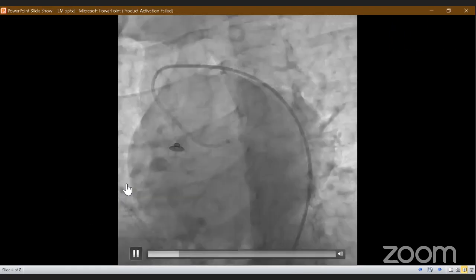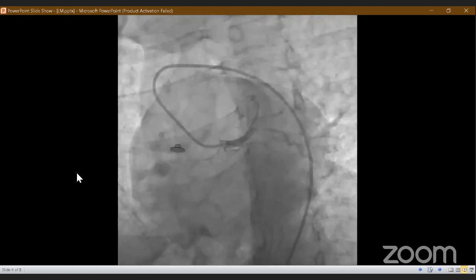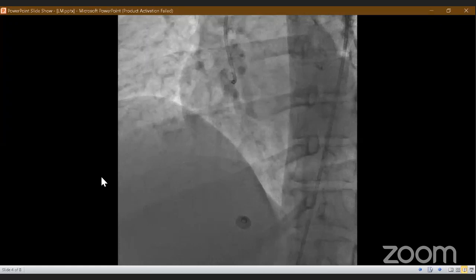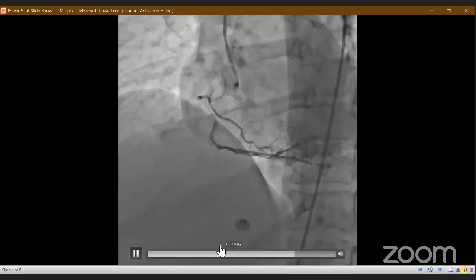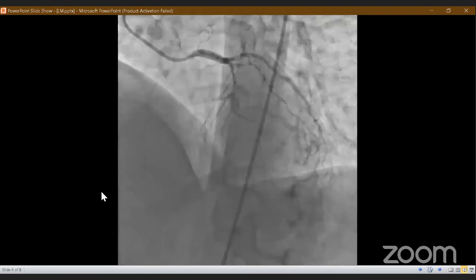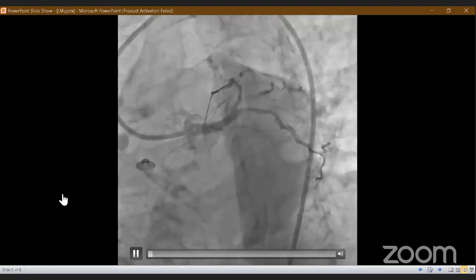We have here, our thinking was the patient was unstable or about to be in shock. She was not shocked at that time, but she was compensated with tachycardia. The second thing, the discrepancy in the caliber between the LAD and the LCX and the proximal left main. And the acute situation with the severe chest pain at rest, even during the coronary angio, that was not controlled even with analgesic.